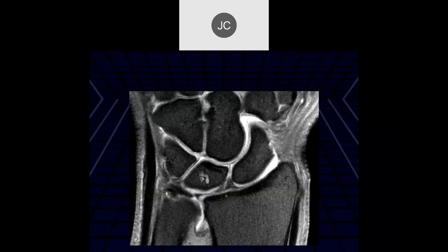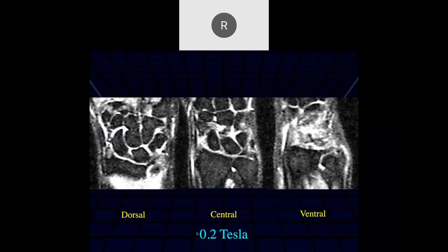Robert: here it looks like there may be another central perforation of the articular disc of the TFCC, with a little fluid going into the joint space. That's on a 3 Tesla. This is on a 0.2 Tesla, and here we can see dorsally the TFCC looks intact, centrally there's a defect, and ventrally it looks intact — this was also a central perforation.